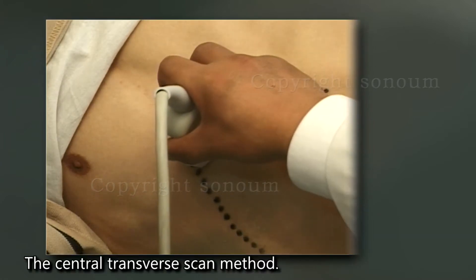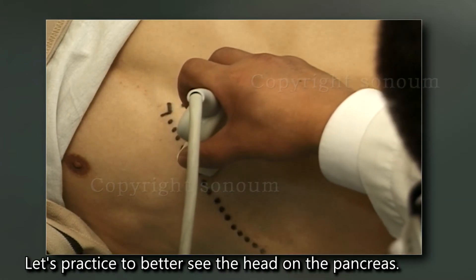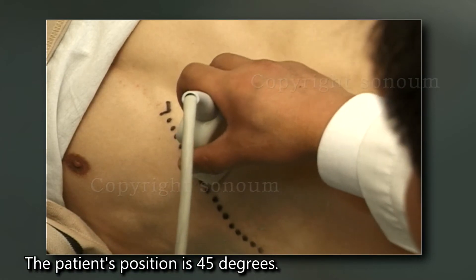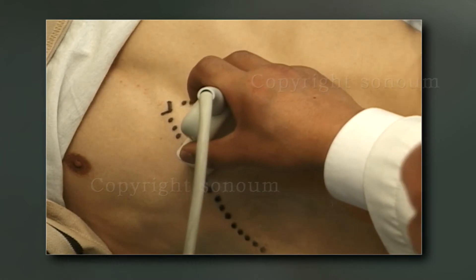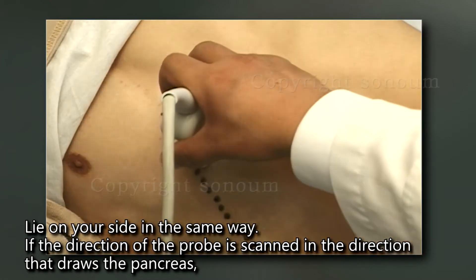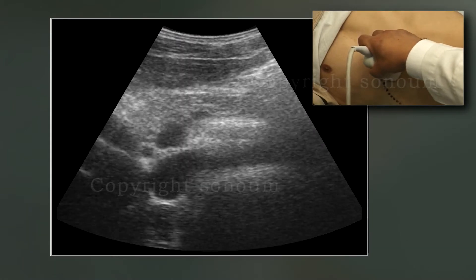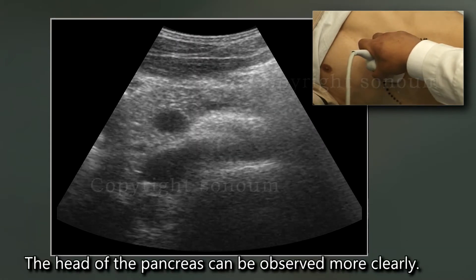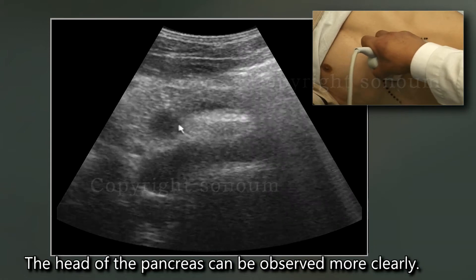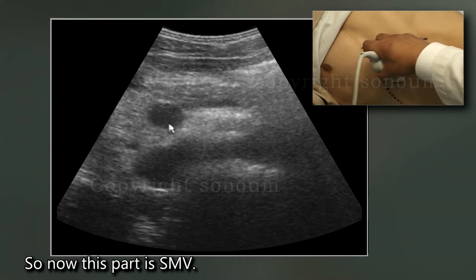This part here is the SMV. By using this approach to see the pancreas, the head of the pancreas can be observed more clearly. This part is the SMV.